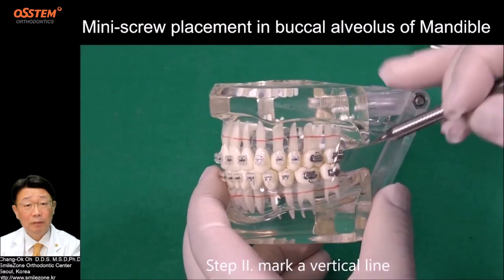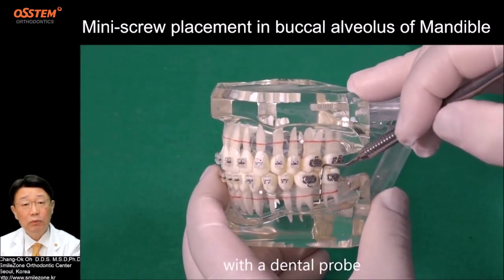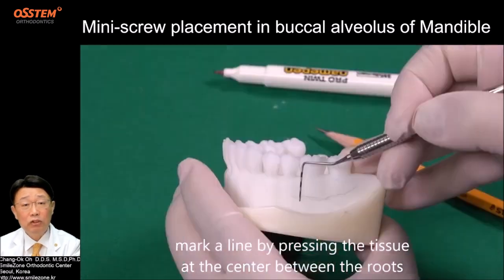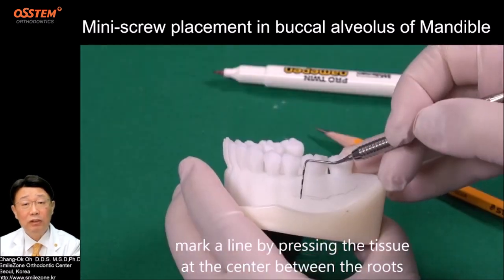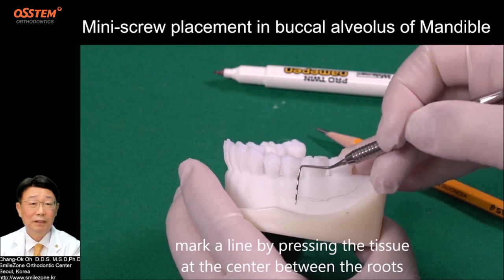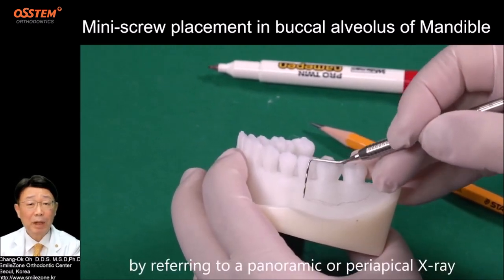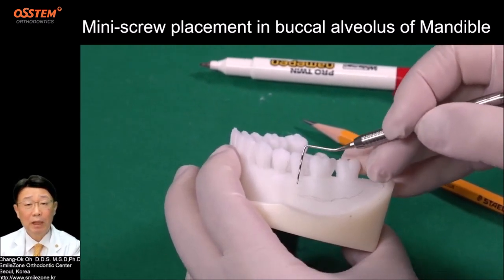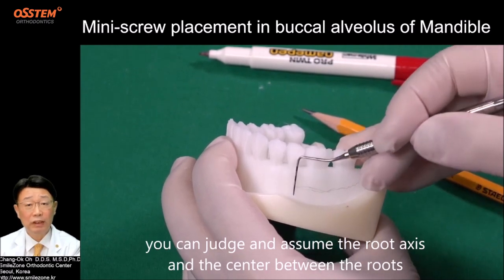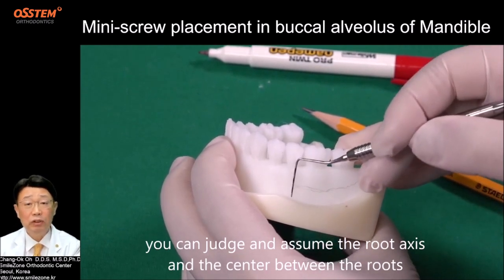Step 2: Mark a vertical line. We then make a marker line by pressing the tissue at the center between the roots. By referring to a panoramic or periapical radiograph, you can judge and approximate the root axis and the center between the roots.